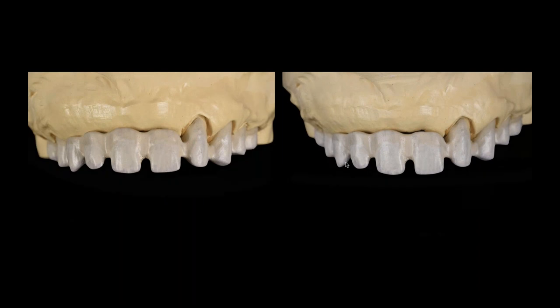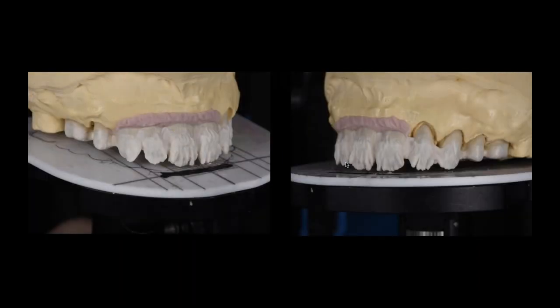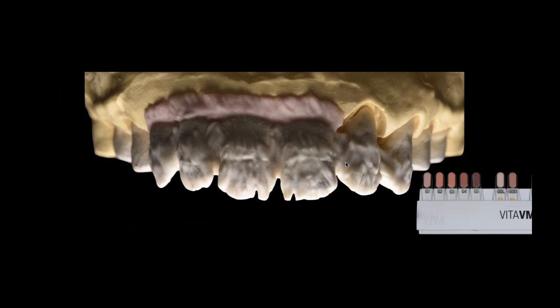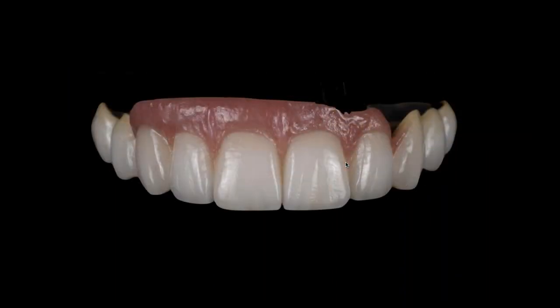So the framework is opaque. I'll start the normal build-up process of building this to my table, which I think I've gone through in some of the lectures. If not, maybe this is a lecture for us, Jim, about managing not only the occlusal, but the aesthetic parameters through face bow and using a table or a reference for horizontal. So the buildup gets rolling. I'm using my opaque dentin materials, or in this case, my Chroma Plus and Effect Chroma materials to start my major buildup. Kind of rushing through this now because you guys get all the buildup stuff that we've done so many times, working in a little brightness and whiteness around the middle thirds, getting my dentin structure coming along. And then I'm going to start actually working through some of the enamels. I'll finalize the whole case.